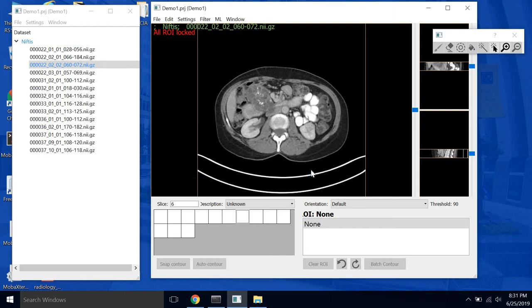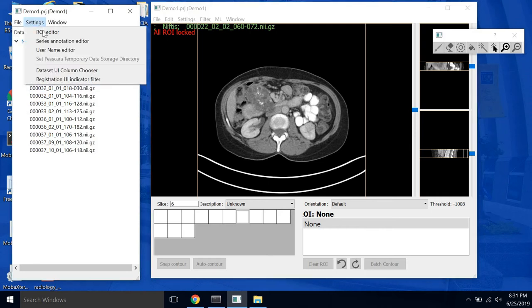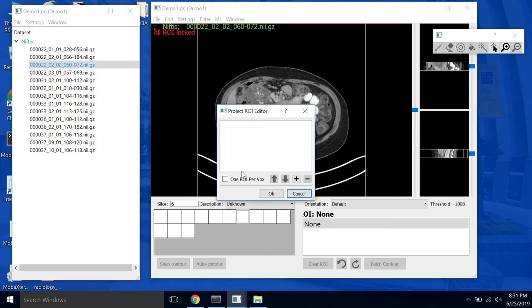So to create a new ROI we want to go to the project window here. We'll go to settings, ROI editor.